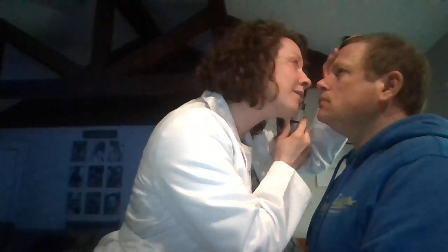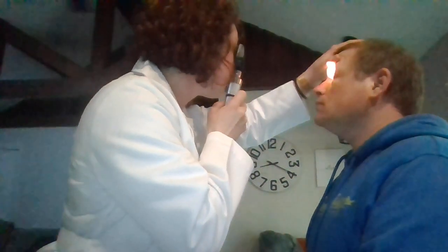Okay, very good. I'm going to put my hand on top of your forehead because I'm going to have to get close to your face and I don't want to run into you. Okay. I see your optic disc. It's a nice creamy orange color. I see the smaller arteries that are lighter and the darker veins that are larger. Come over on this side. There's no hemorrhaging or cysts. Your optic disc is orange and creamy on this side too. It is about 3 times as large as the cup. Very good.